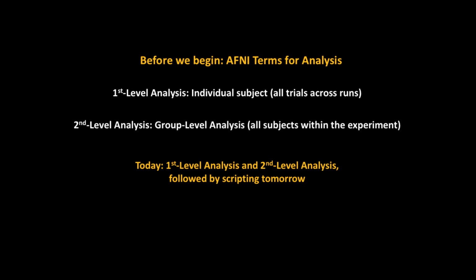I'm actually not sure how that's modeled exactly. That'd be something I'd ask the people. Janet actually has the entire explanation of that on her website, like how to run contrasts and stuff like that. She's referring to Jeanette Mumford, who's a statistician.